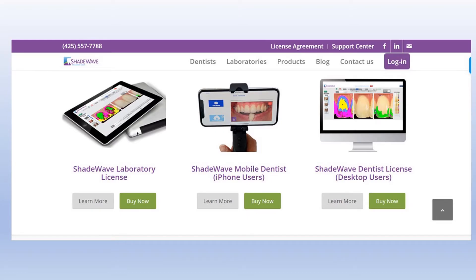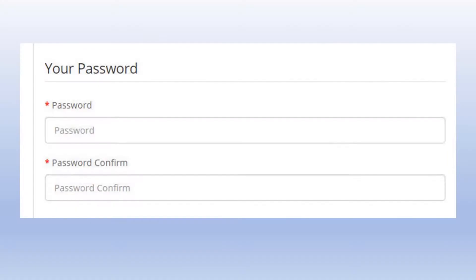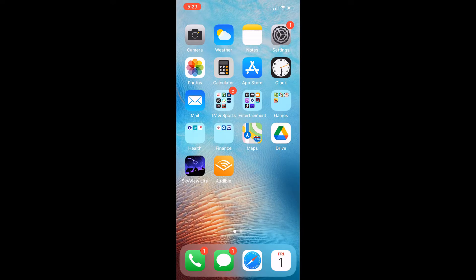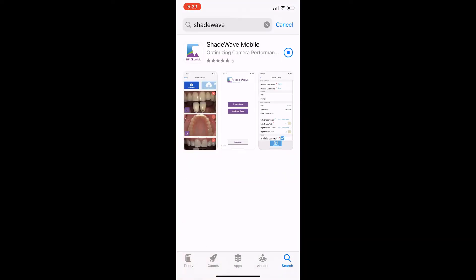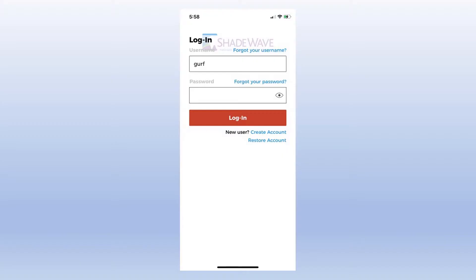In the process of purchasing ShadeWave Mobile Dentist, you'll create your username and password and activate your account. Next, go to the Apple App Store, search for ShadeWave Mobile, and download the app — that part's free. When you launch the app, use the credentials you created.